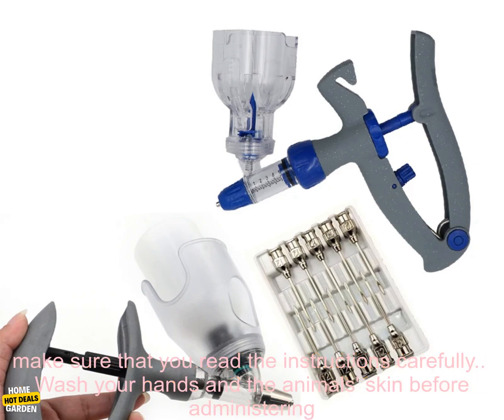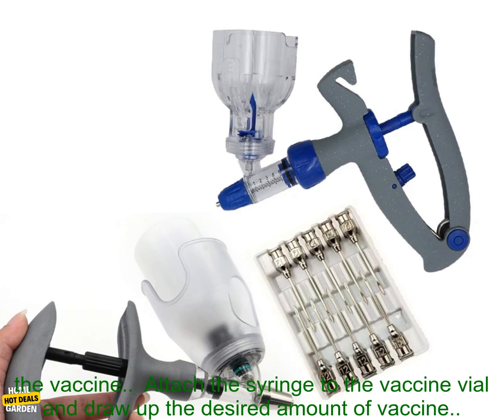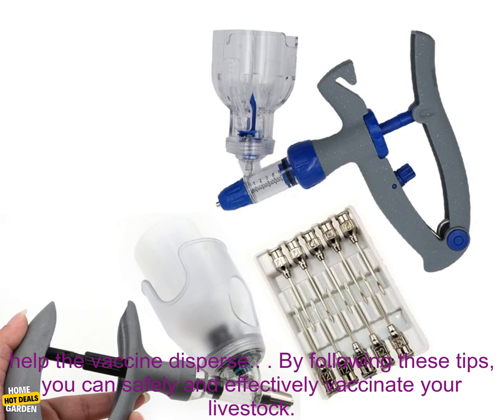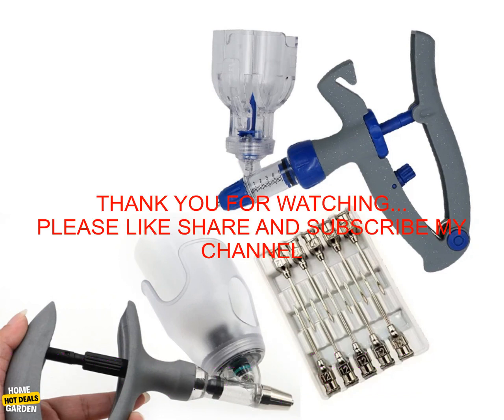Here are some tips for using the syringe. Before using the syringe, make sure that you read the instructions carefully. Wash your hands and the animal's skin before administering the vaccine. Attach the syringe to the vaccine vial and draw up the desired amount of vaccine. Insert the needle into the animal's skin and inject the vaccine. Massage the injection site to help the vaccine disperse. By following these tips, you can safely and effectively vaccinate your livestock.